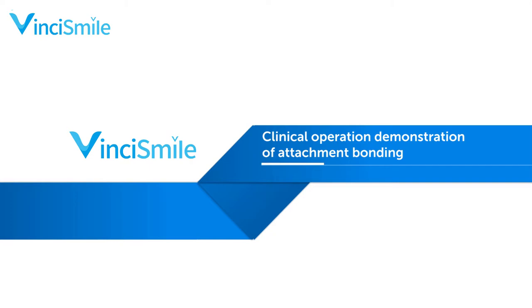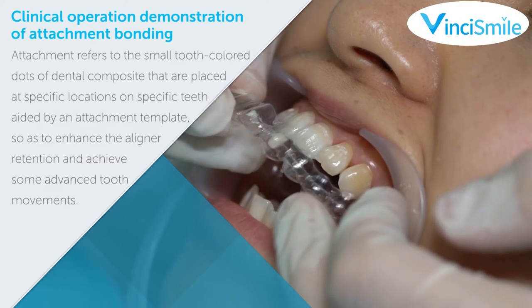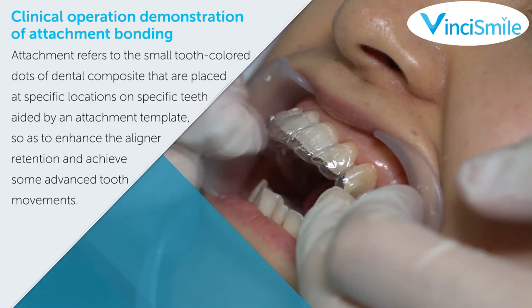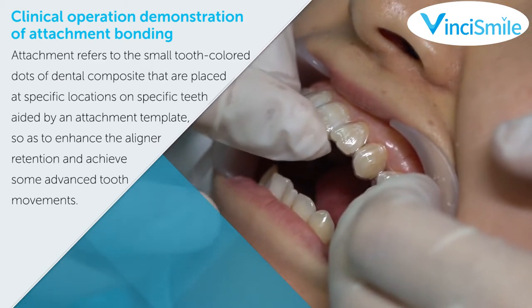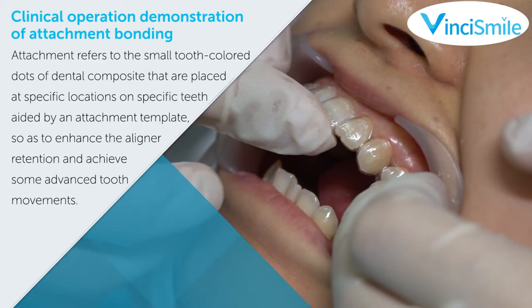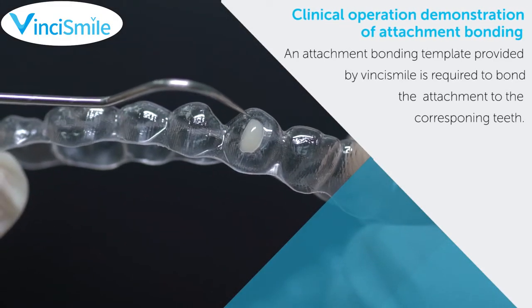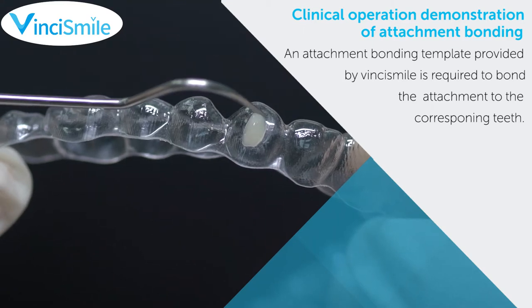Clinical operation demonstration of attachment bonding. Attachment refers to the small tooth-colored dots of dental composite that are placed at specific locations on specific teeth, aided by an attachment template, so as to enhance the aligner retention and achieve some advanced tooth movement.